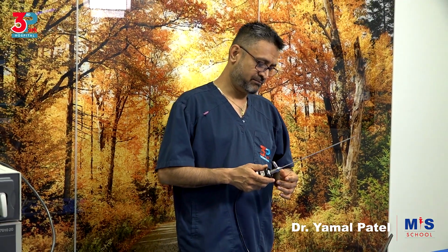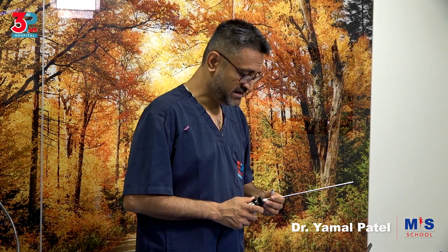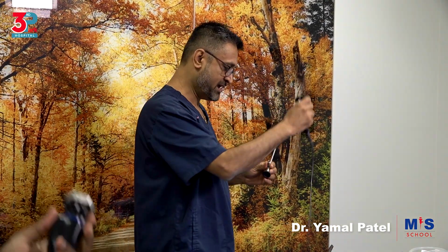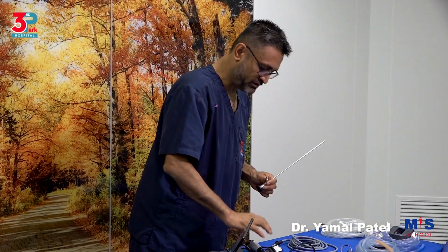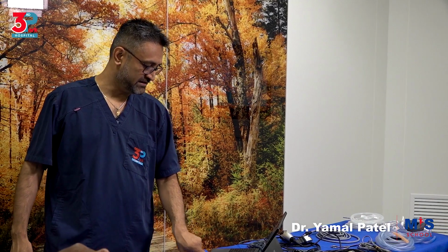The different parameters that we would use is the definition. We have the standard definition, HD, Ultra HD, we have 4K cameras, and we also have 3D. We have the sensitivity, the resolution, we have zoom, we have focus. So that's what we would use this camera and the settings for. We're not going into that so much in detail.